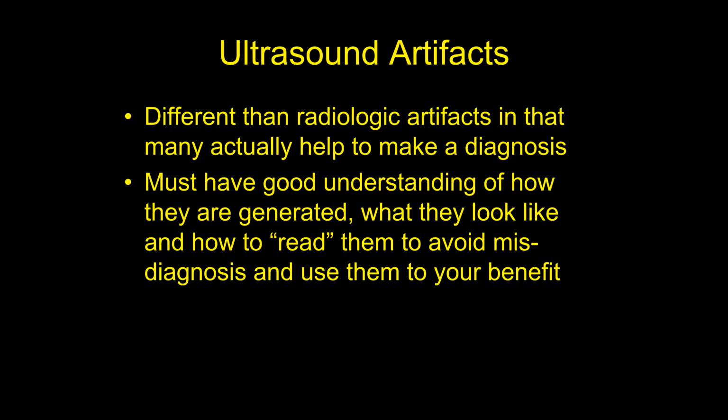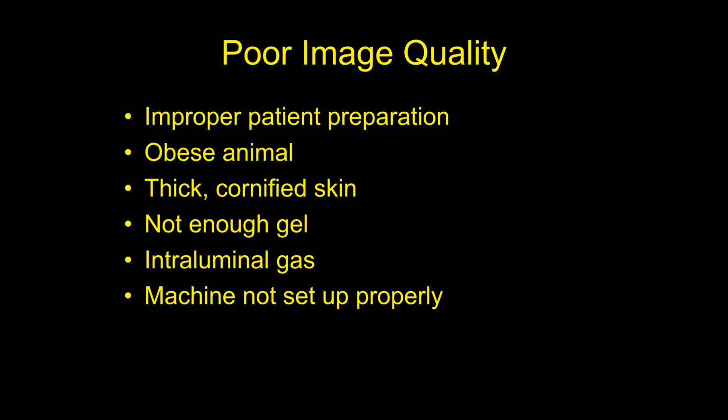With radiographs, if there's an artifact, almost always it hinders our ability. It gets in the way, it hinders our ability to make a diagnosis. It makes a picture ugly, whatever. But some of the ultrasound artifacts actually help us make a diagnosis. And that's why we had to spend a little time talking about physics, which you'll understand here in a minute.